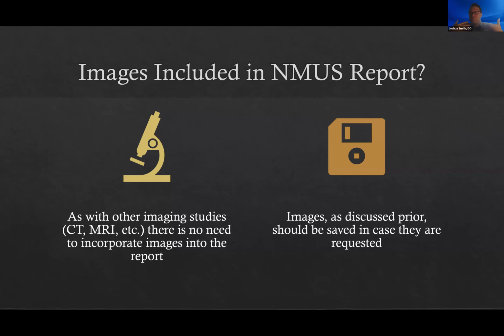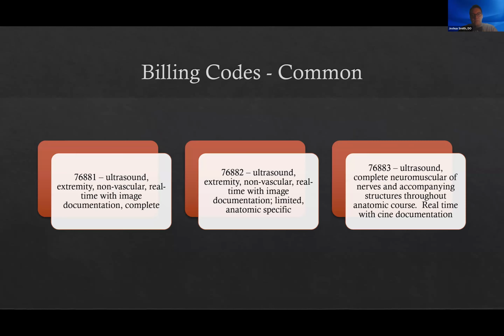You should be able to provide those images to your practitioners if they ask for them, but they don't actually have to be on your report. It is nice sometimes if you include a key image on there, but if your machine is a standalone machine and moving things is trouble, it is not needed formally for reports and billing. So it's nice if you can, but you do not have to do that. And that does not have to be there for you to bill.